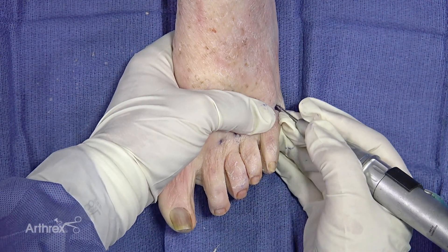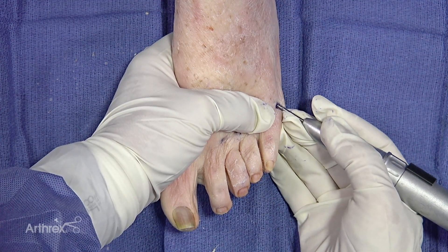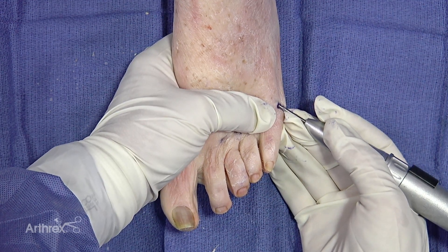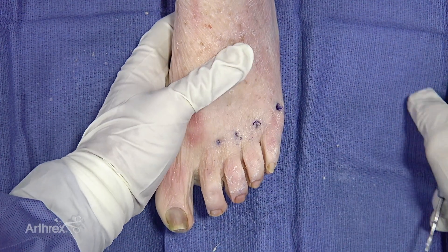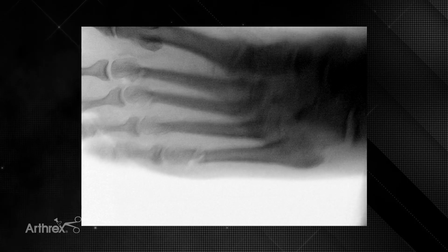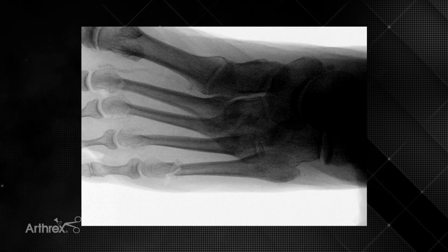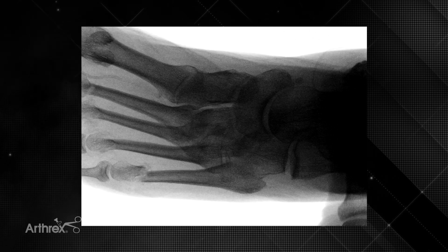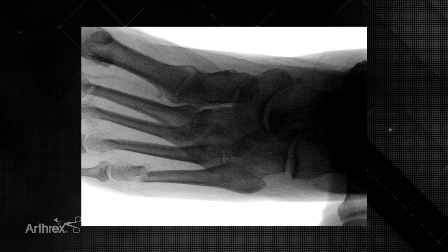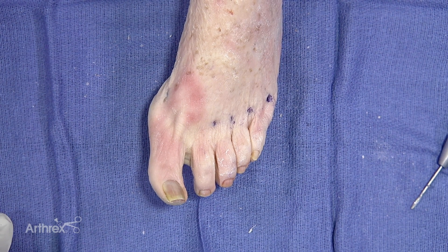So that's what we'll do here. You're both translating and pivoting off your incision. That's more of a 45-degree cut, as you can see. Basically, that is allowed to translate — we can translate it over like so. You could pin it if you wanted. Post-op protocol for a bunionette would be toe strapping and weight bearing as tolerated in a post-operative shoe or boot walker. I usually put one 4-0 Prolene suture; in Europe they do a Steri-Strip.